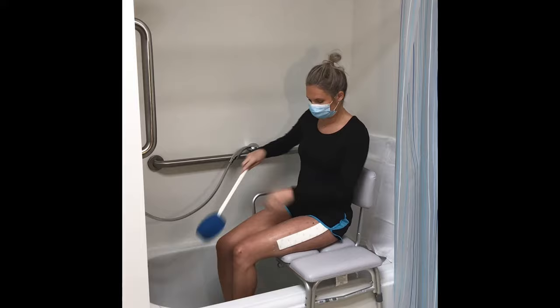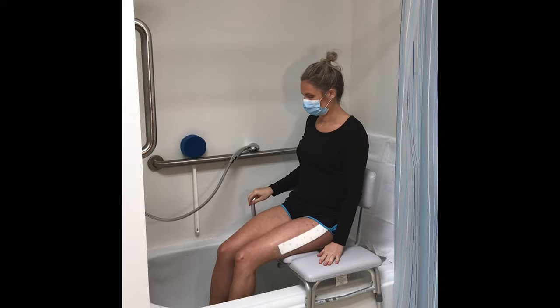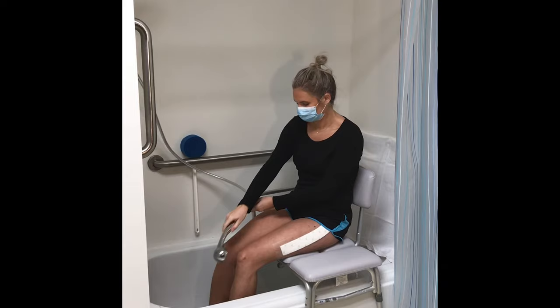Use a long-handled sponge for washing your lower legs, feet, and back. Be careful to avoid bending or twisting your surgical hip while bathing. Move soap and sponges within reach so you don't have to twist or reach below your knees. A handheld shower hose is also helpful for getting clean without bending.